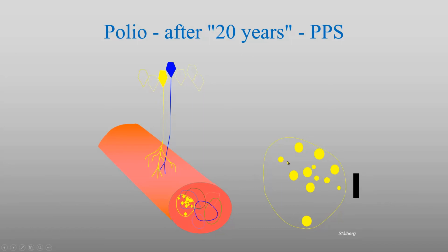And therefore this patient should not exercise more, because even normal walking is a great exercise. But we say that they should save their neurons, at least in the patient that have a severe loss of neurons. And we measure that with macro EMG to see if they have lost many motor neurons or if they have lost fewer. This is one technique. Other techniques can be motor unit number estimation, but this is similar but with needle EMG.